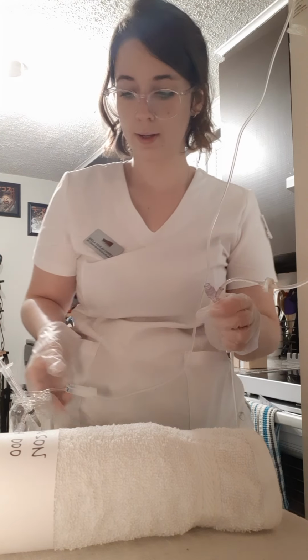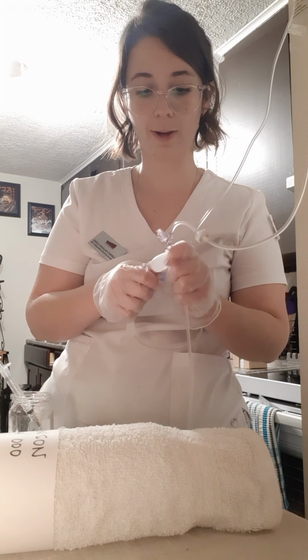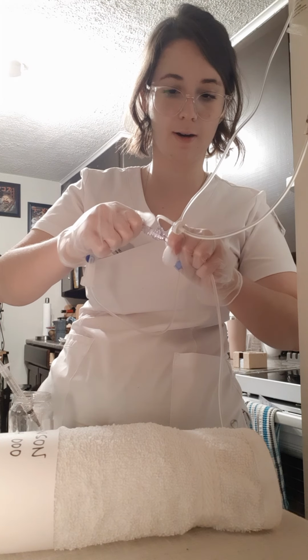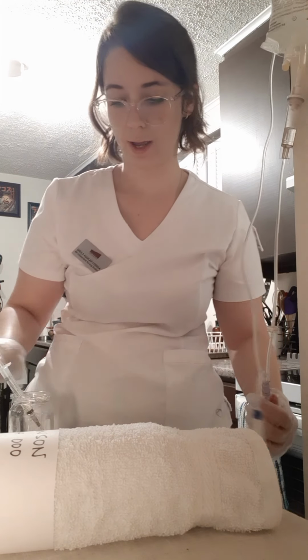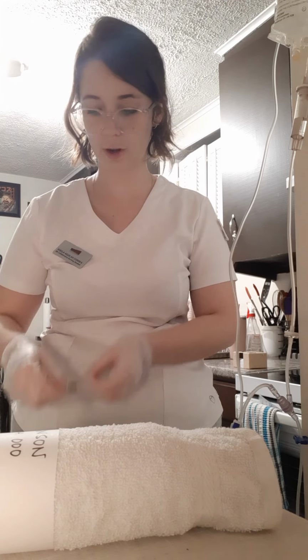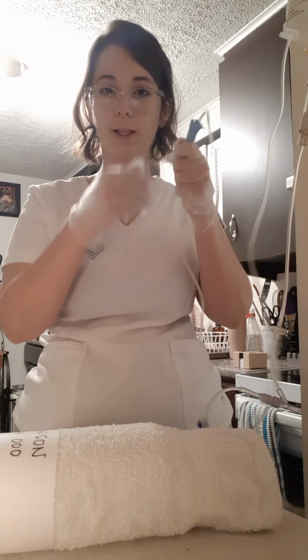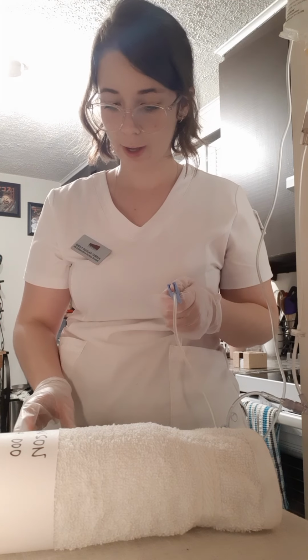It's clean, and again keeping sterile technique, I'm going to take my piggyback bag right there. That's perfect. Now I'm going to set the rate of 7 drops per 15 seconds using the clamp at the primary line.